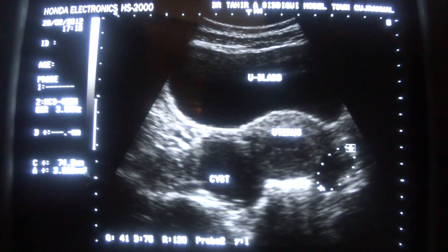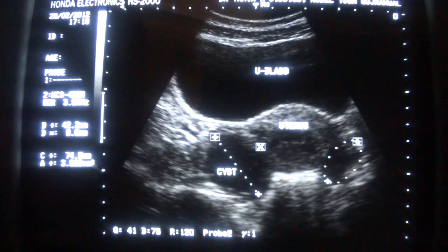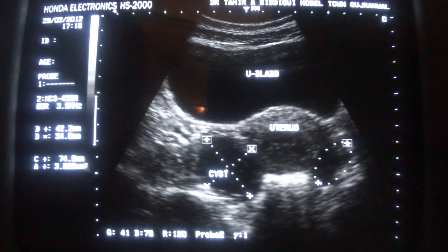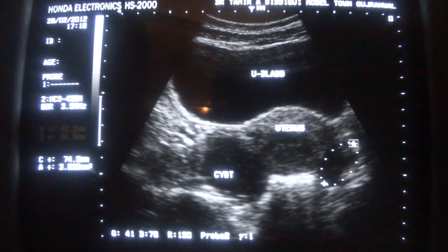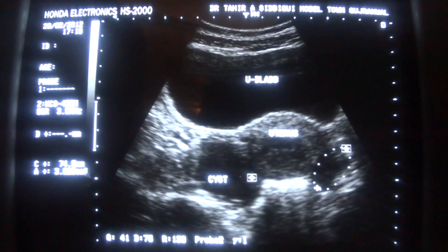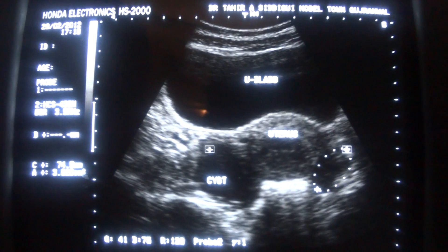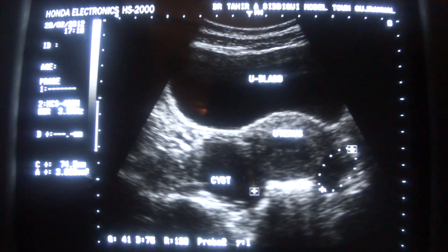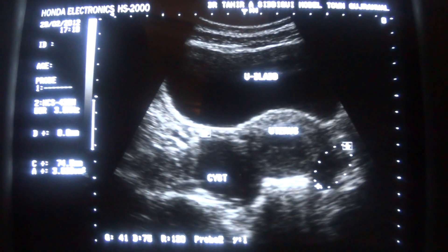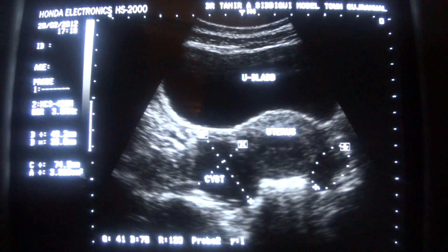This cyst in the right adnexa measures 4.2 cm by 3.4 cm. These cysts are internally clear with no calcification, no septa, no debris, no solid element, and are called retention ovarian cysts. This is a retention ovarian cyst because less than 5 x 5 cm is classified as a retention ovarian cyst.